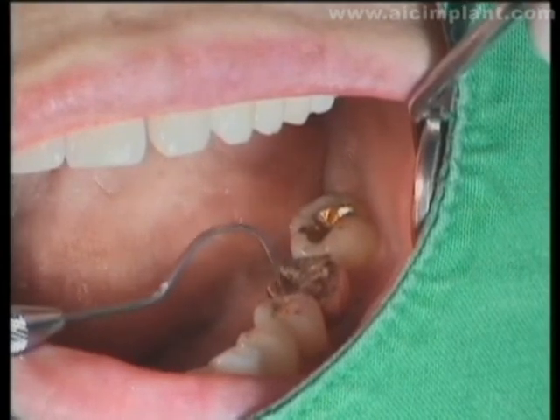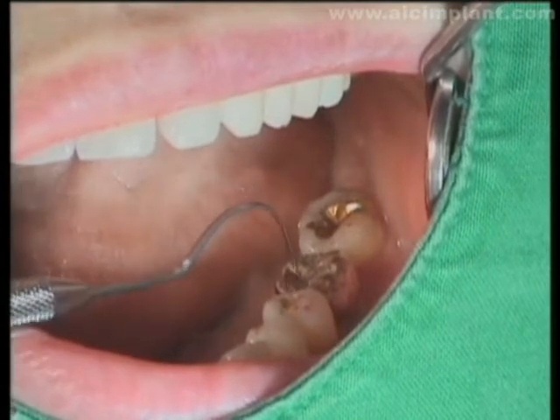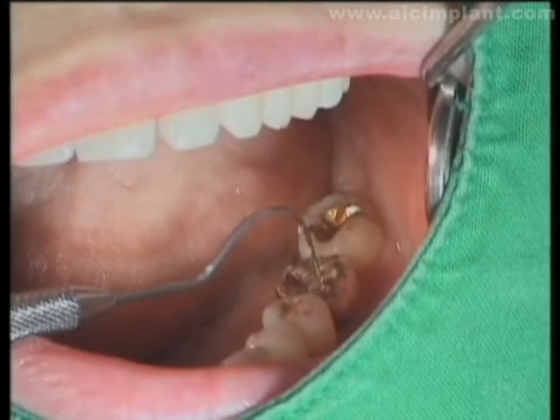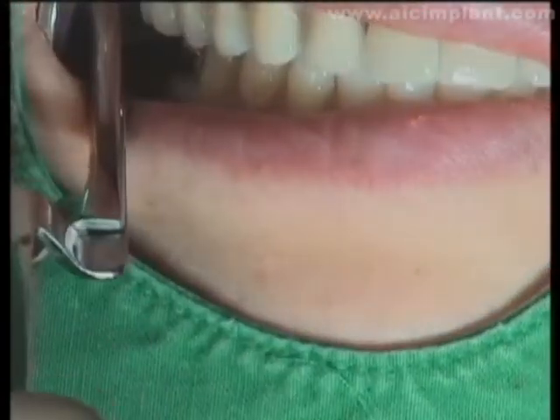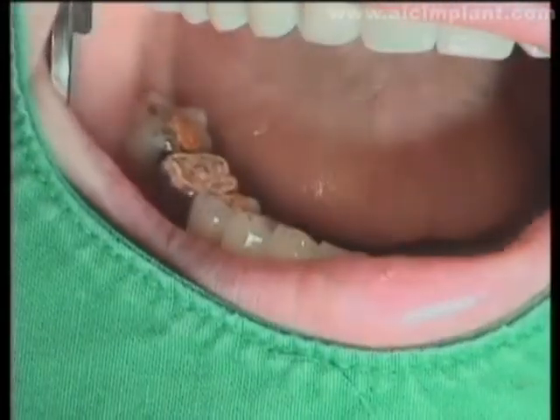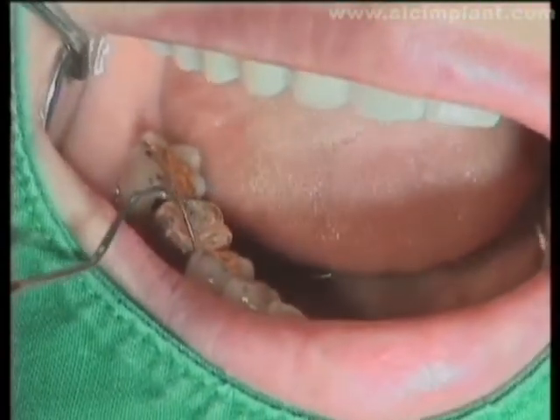The natural teeth must have a slightly stronger bite, although the implant must have a weaker bite following occlusal adjustment. Of course, this does not mean that an infra-occlusion must be made.